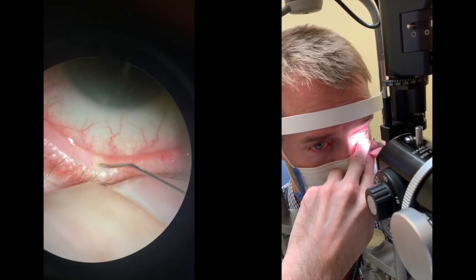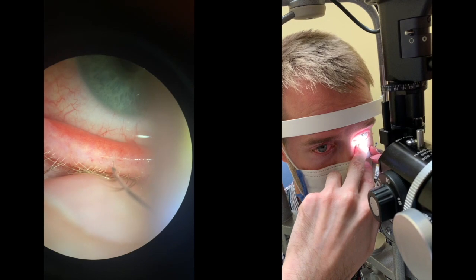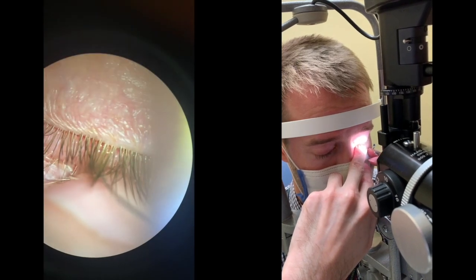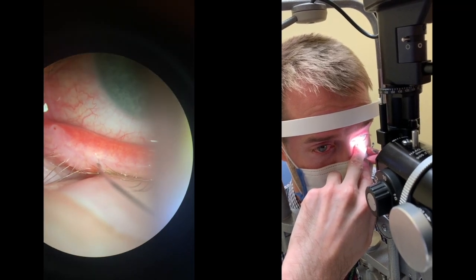At the end of the procedure I tend to try another expression of the lids, since if the meibomian glands are open they should allow for better flow. Meibomian gland probing by itself is not as useful or helpful as combining it with IPL treatments.